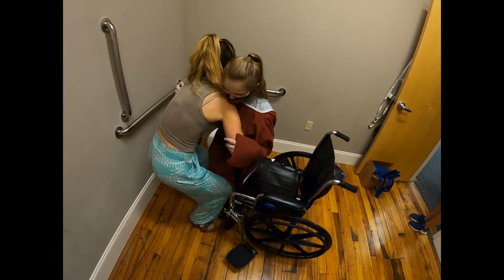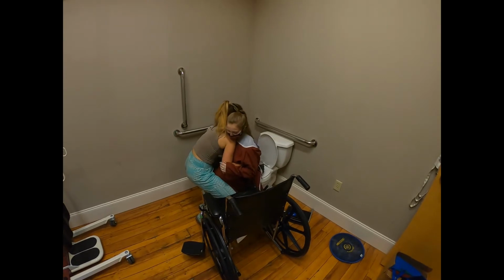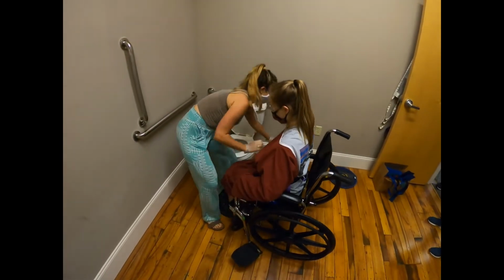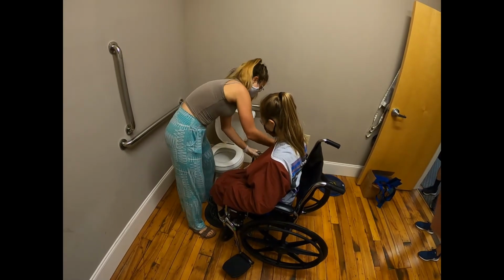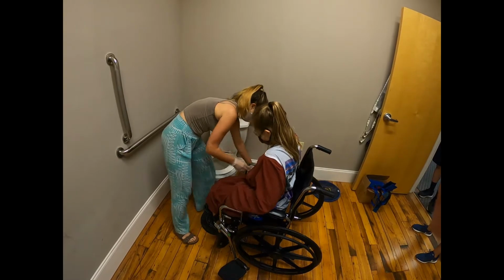Make sure that your body remains close to your loved one and reach around their torso to firmly grasp onto their gait belt. Have your loved one lean forward over their feet, and you and your loved one are going to do the work to pivot them back into the wheelchair. Once your loved one is seated, replace the footrests or any arm rests that you removed from the beginning.